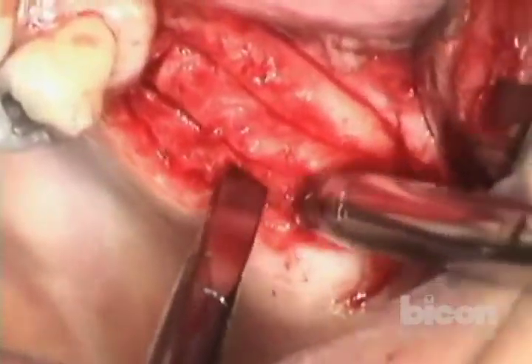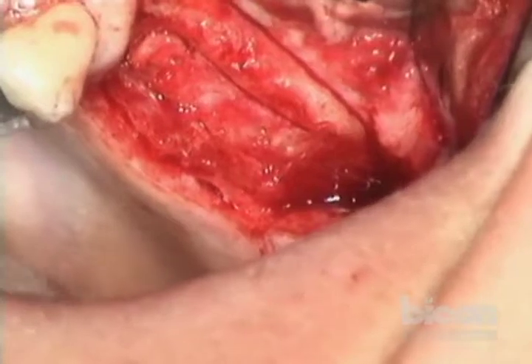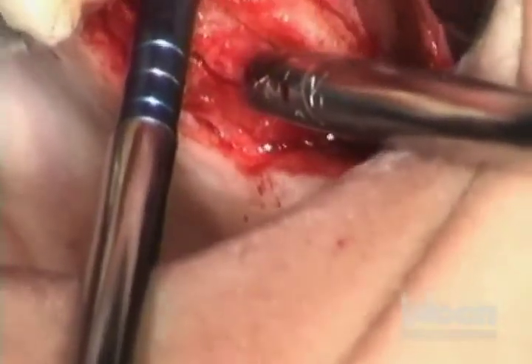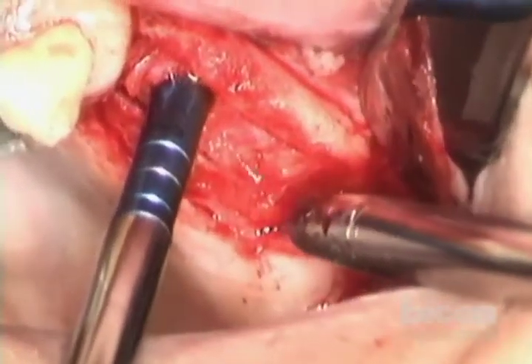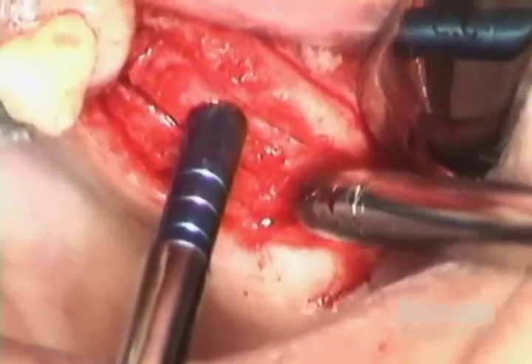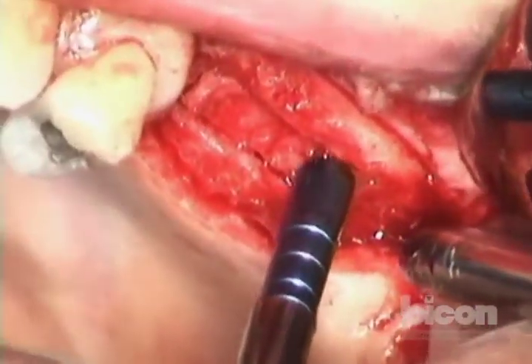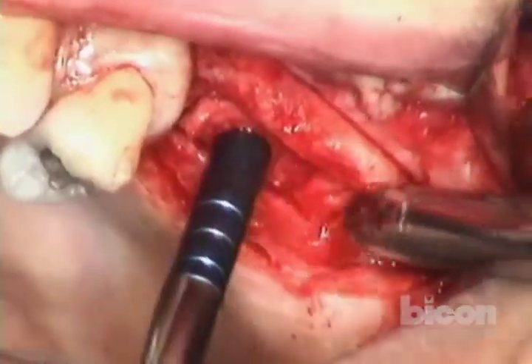And immediately, as soon as we freed up the corners, I feel a little bit more movement now — a lot of tapping with this technique. We're moving already. You can feel, or maybe you can see, how that is starting to sort of fall into the sinus. You probably see it better than I can.